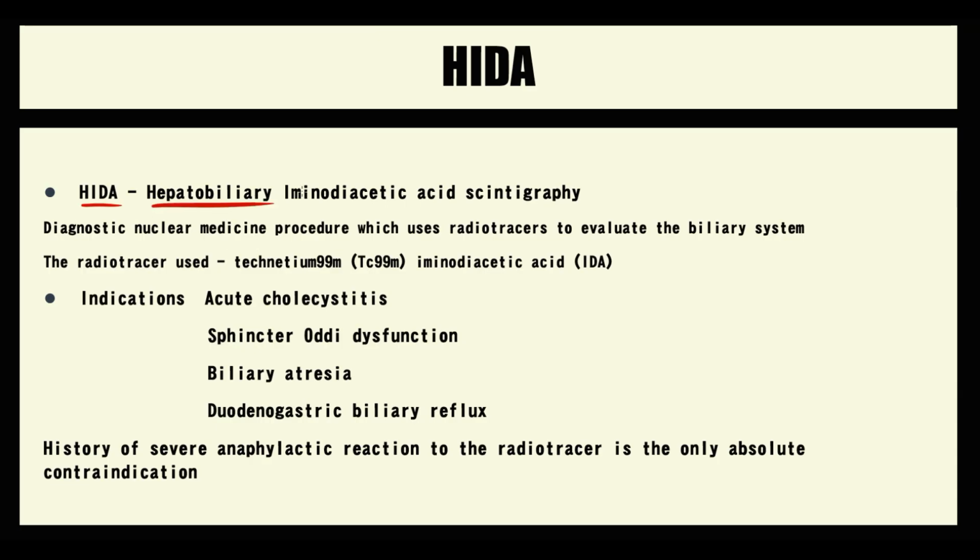Hepatobiliary iminodiacetic acid scintigraphy is a diagnostic nuclear medicine procedure. For this procedure, we use a specific radiotracer, technetium iminodiacetic acid. So to explain how this method works, we have to recall physiology.